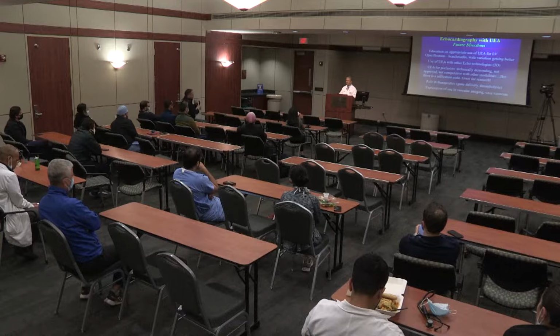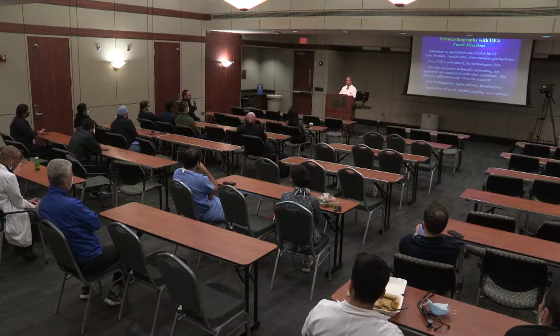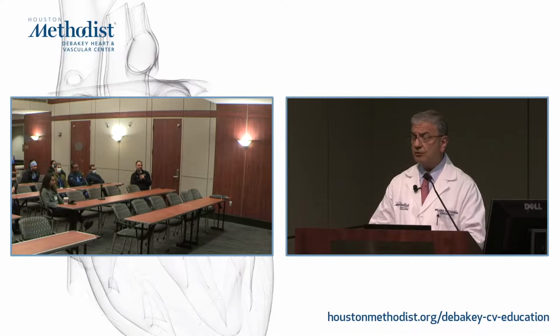Yes, I think what Safi said, he was talking about what cutoffs we use when you use contrast versus non-contrast measurements of the ventricle. I always say, when you use contrast measurements, you're getting away from guidelines but closer to truth, maybe. Yes, that's true. So you have to kind of weigh it, as to which number to use. What is the clinical scenario? Is there an explanation for possible LV enlargement, for example? So you have to put it together.